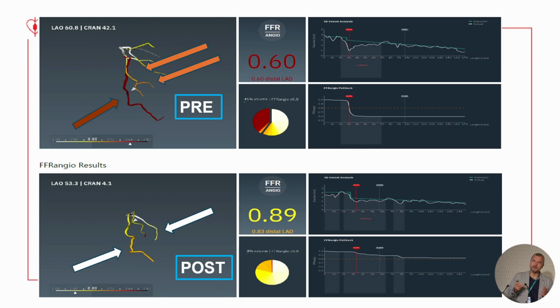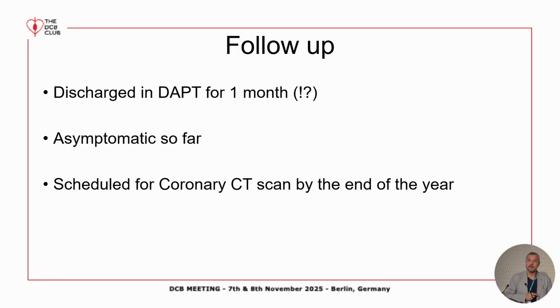We can discuss forever what is the right indicator to select a good or acceptable angiographic result. Nevertheless, if physiology tells us you have fixed the ischemia, there's no more ischemia, then we can discuss the section, the angiography, everything else. But to be honest, I think that if you can do this for the patient, it's a good thing.